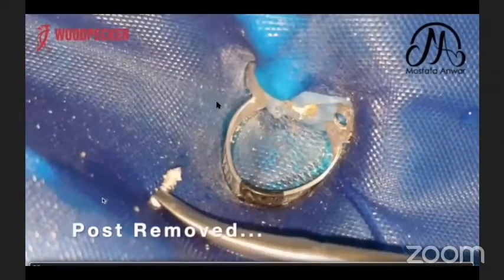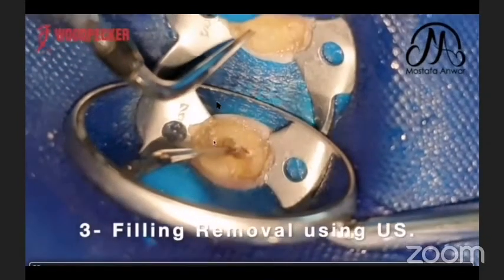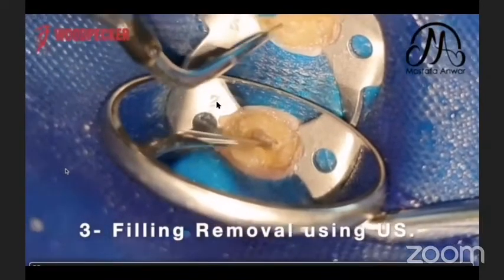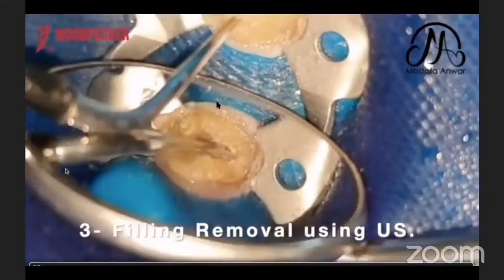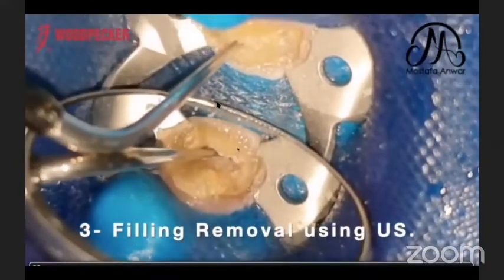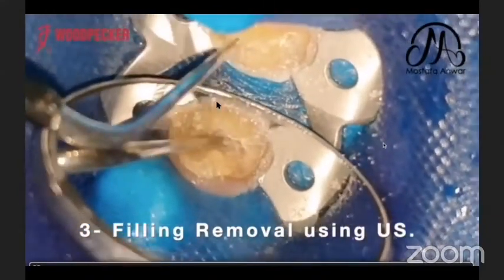The cement was covering the orifice of the canal, so I had to remove it using the same tip with an active cutting end. Once the cement was removed, I could proceed further with my retreatment procedure.